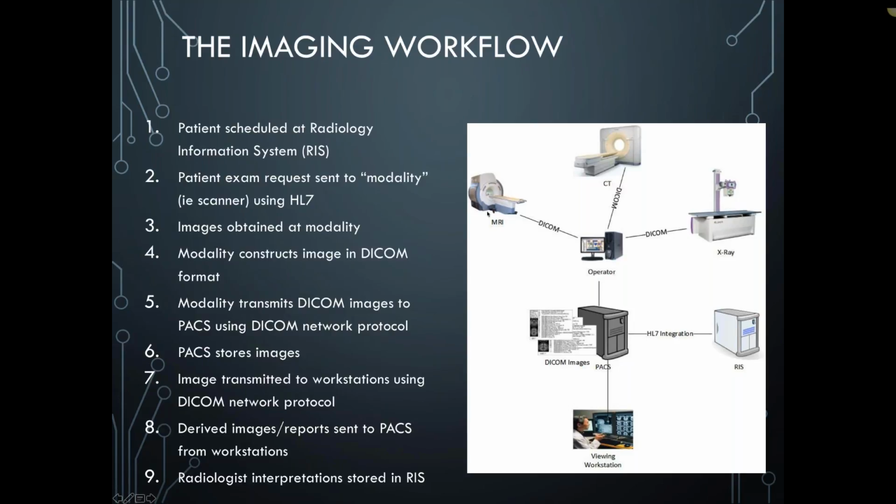And once the images are obtained at the modality, then those images are transferred to some sort of data system using the DICOM protocol. We'll talk quite a bit about DICOM in the coming up slides. Within a clinical environment, the images are typically sent to a PACS, and they're sent over the DICOM network protocol. The PACS is the thing that actually stores the images.